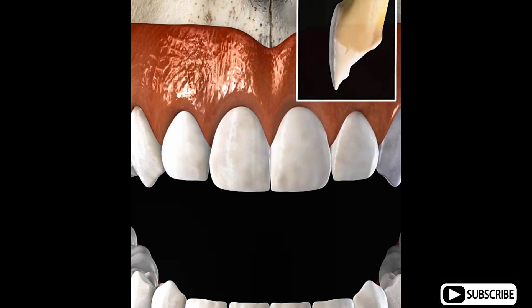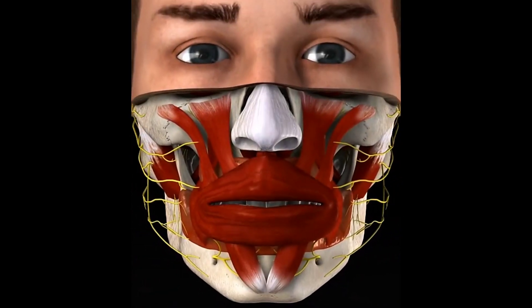When complete, the spaces between the teeth are no longer visible.